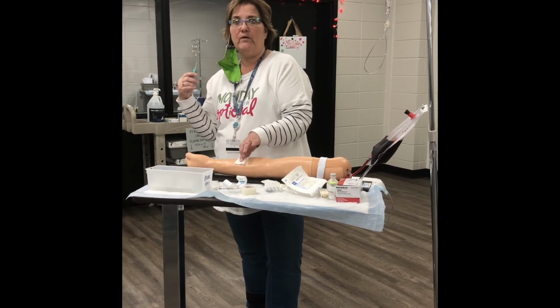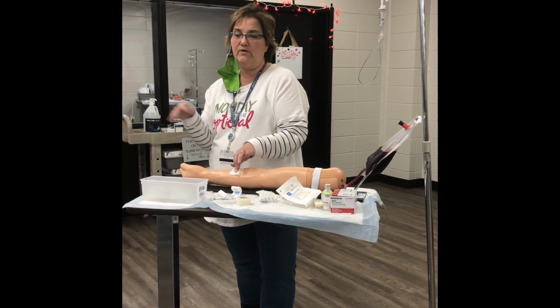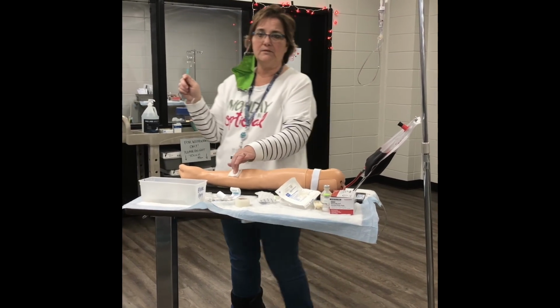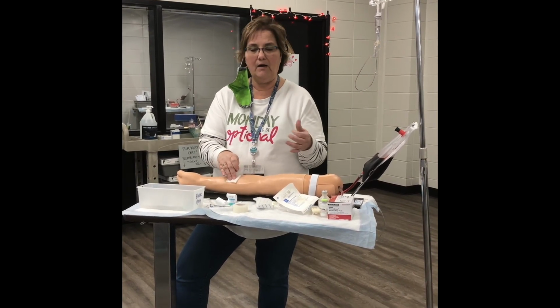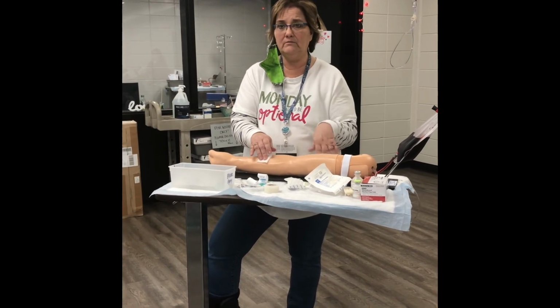Most nurses don't walk around with tourniquets in their pockets unless they're going to start an IV. So if you don't have one, find something. Blood pressure cuff, pump it up. Usually, even now, they still have them on the wall sometimes. But find something to use as a tourniquet. This goes in the sharps container, and you hold pressure until it quits bleeding. How long is that? I don't know, until it quits bleeding.